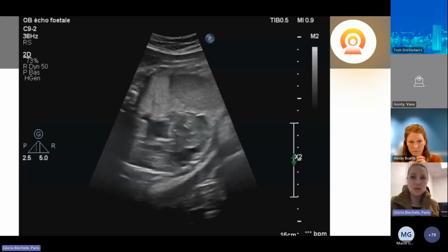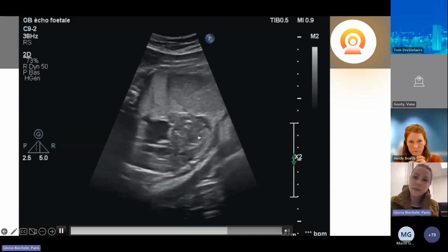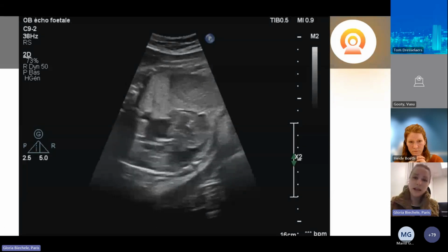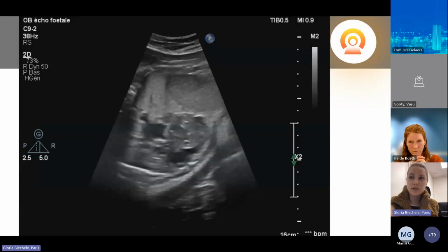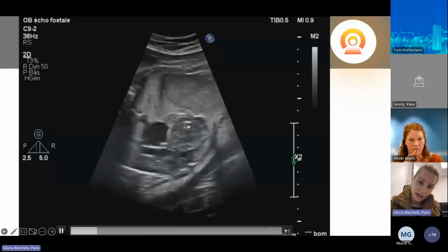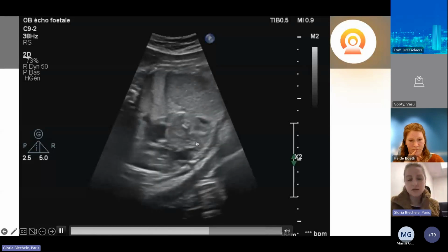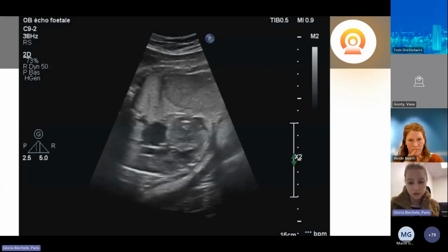What we could state was the appearance of a heterogeneous tumor dependent on the left ventricle here, appearing to encompass the inflow and outflow zone, and thus limiting filling and ejection of the left ventricle. And the aorta, which is not to be seen here, appeared to be fed retrogradely by the arterial duct. So you can see there are zones with hyperechogenic and isoechogenic signal intensity here, and the mass measured, I think, 2.5 x 2.5 centimeters.